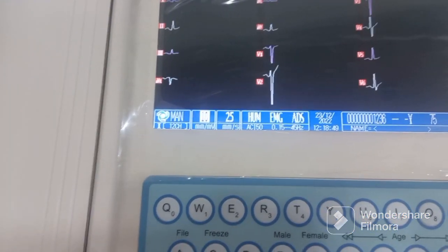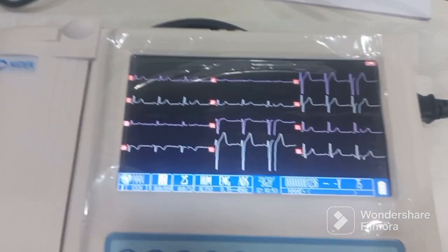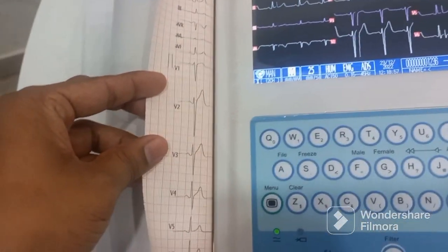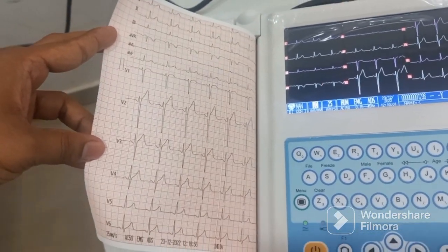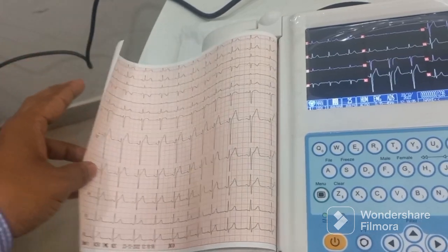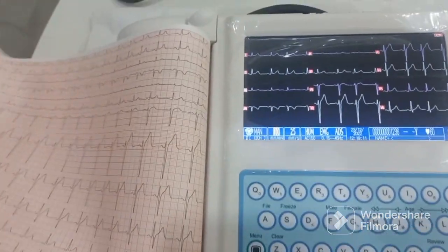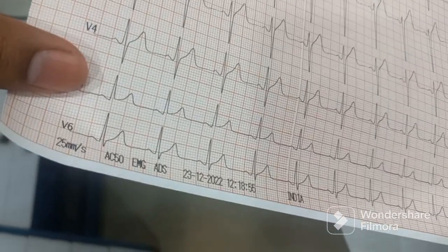Now we'll see the manual mode, which is the long lead mode. Once you press the button you can see the long lead continuously printing. As long as you don't press stop it will keep on printing. Once you press stop, you get the long lead printout along with all the details.